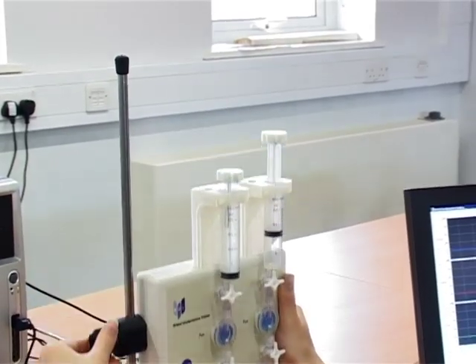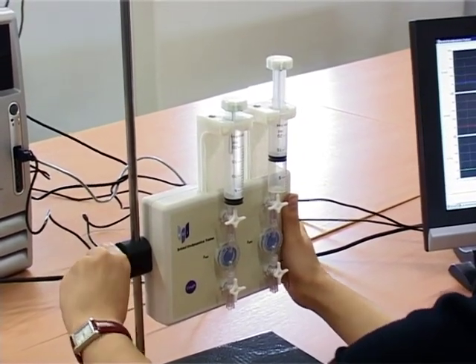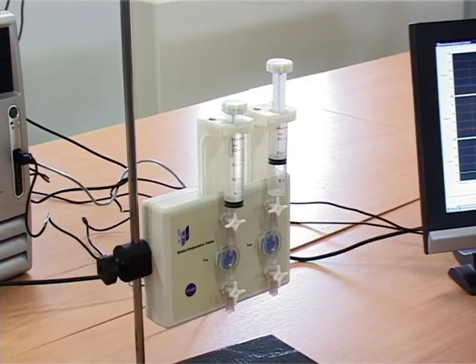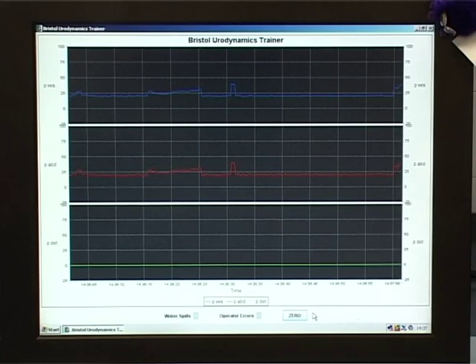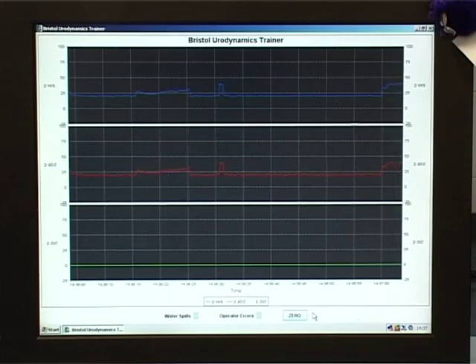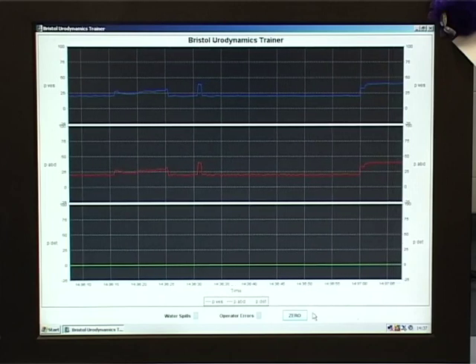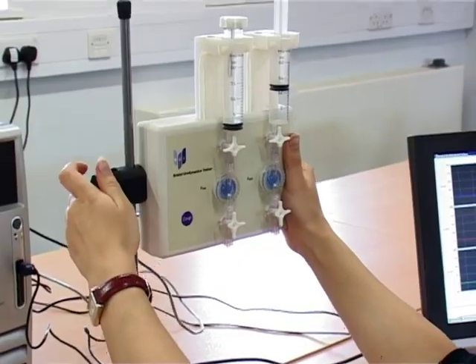Another feature of good urodynamic practice that can be simulated is the setting of reference level. While moving the trainer vertically, the displayed pressure changes due to the relative positions of transducer and patient. Good urodynamics practice is to set this level to the upper edge of the symphysis pubis.